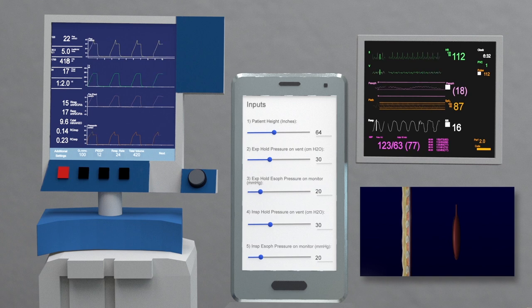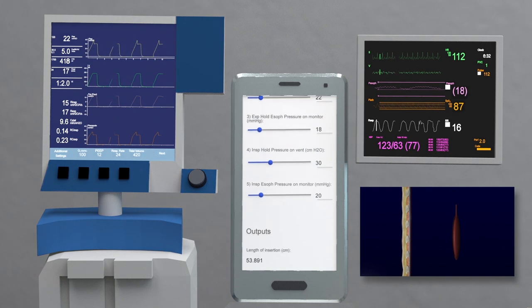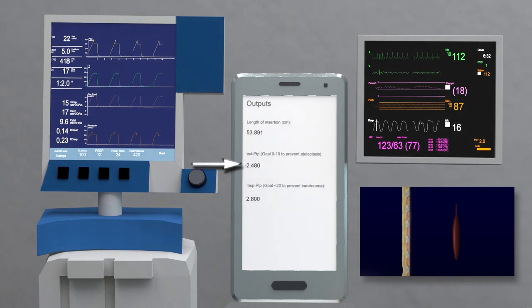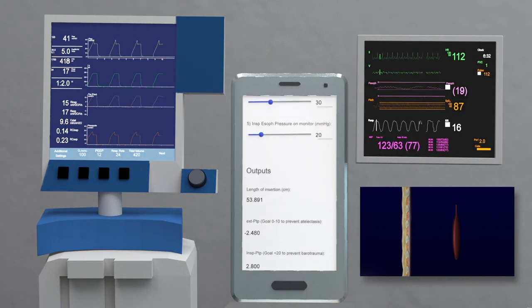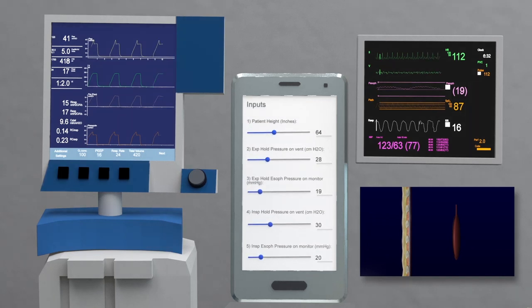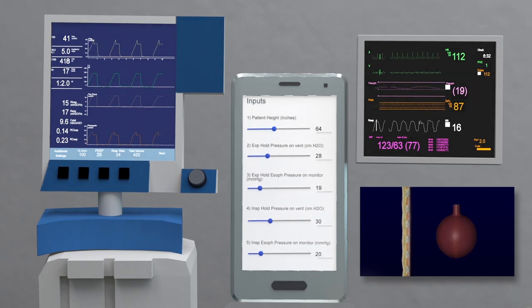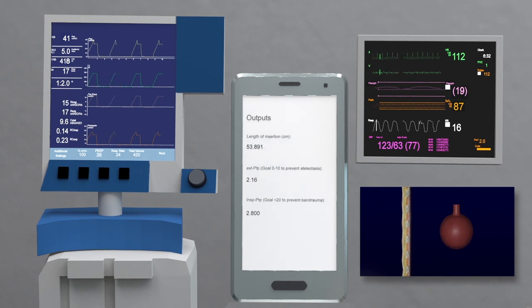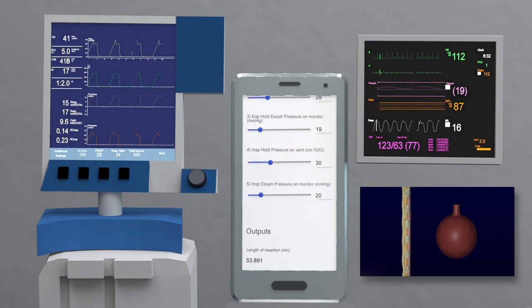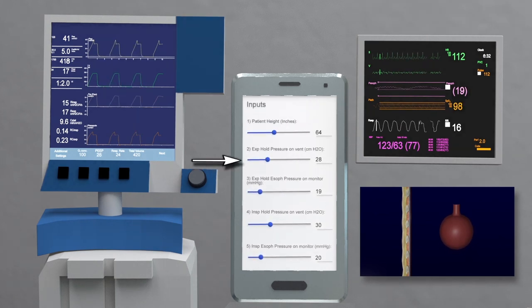We're going to do this by pressing the EXP hold button on the ventilator and setting slider 2 on the calculator to the pressure measured by the ventilator and slider 3 to the transduced esophageal pressure shown on the bedside monitor. Note in this case the end expiratory transpulmonary pressure is still less than zero. Increase PEEP in increments of 2 and repeat measurements until end expiratory transpulmonary pressure is between 0 and 10. In this case the minimum PEEP required is 28.